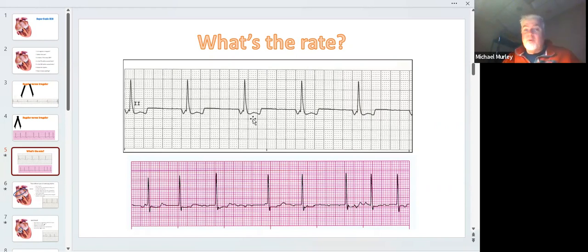Does it mean anything? Well, what's the patient's mental status, blood pressure, respiratory distress, altered mental status? Are they sweating bullets? If their blood pressure is 130/80 and their skin's warm or dry, color good, and they got a good mentation, then it really doesn't mean much, right? Because they're perfusing just fine with that rate. We already did this AFib one on the bottom.